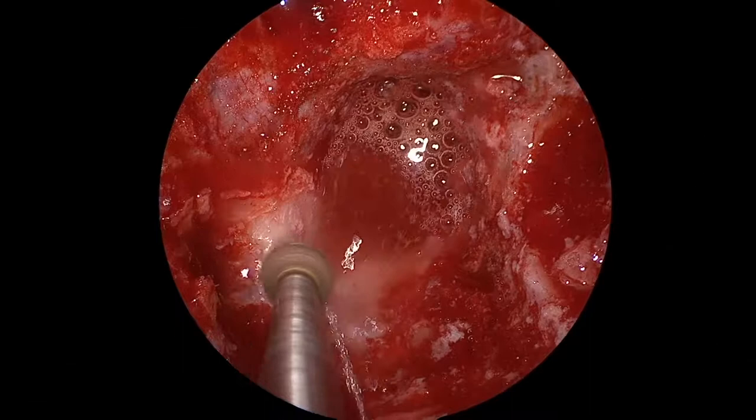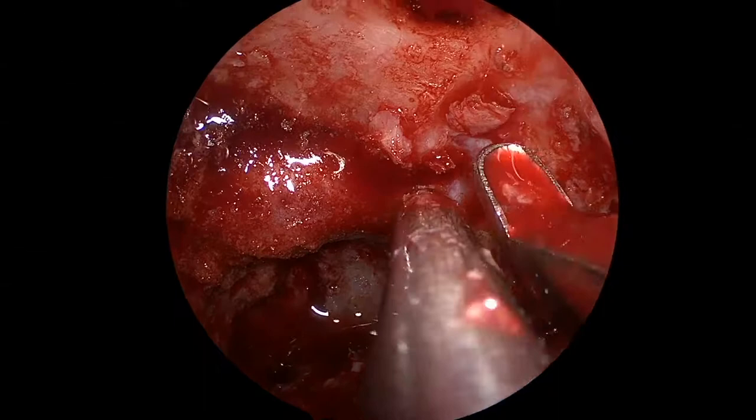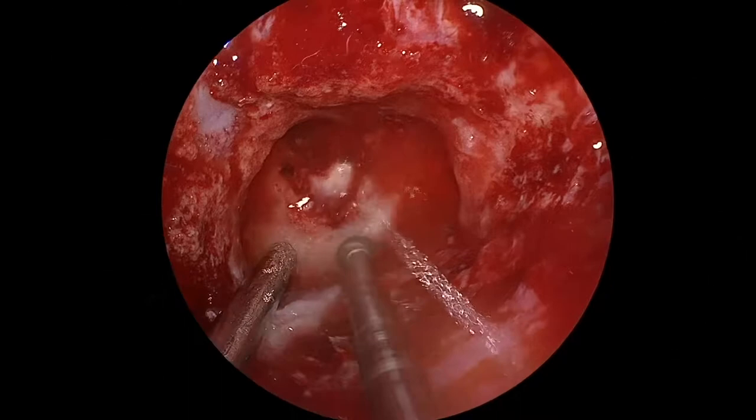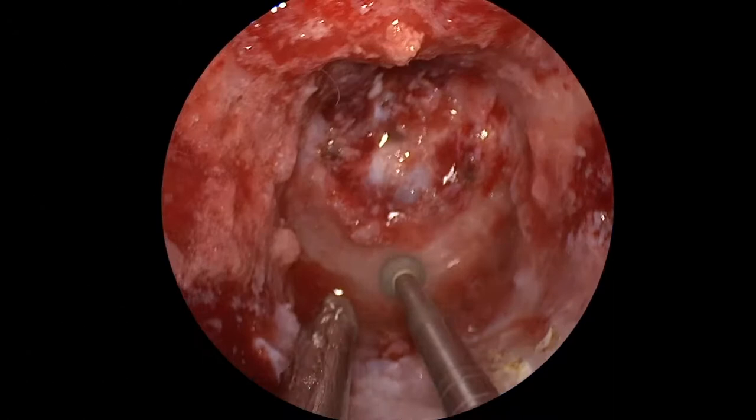We have now performed our endonasal endoscopic approach. We are working transclival, exposing the right carotid artery on the paraclival segment down to the lacerum segment. Now we are exposing the paraclinoid carotid artery on the left side. Now we're drilling the mid-clivus, and we start seeing tumor invading in between the two layers of dura, as is so typical for these clival cordomas.